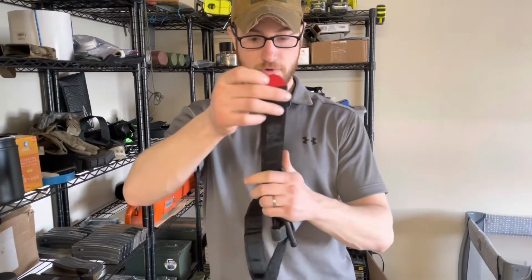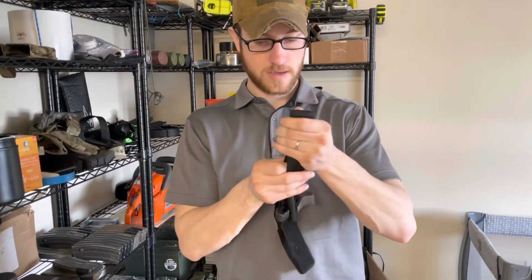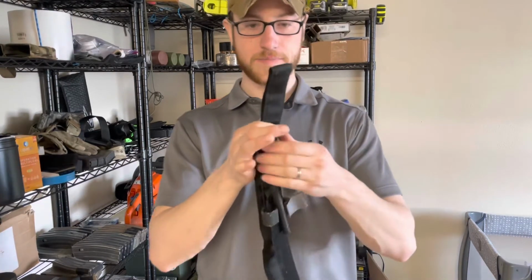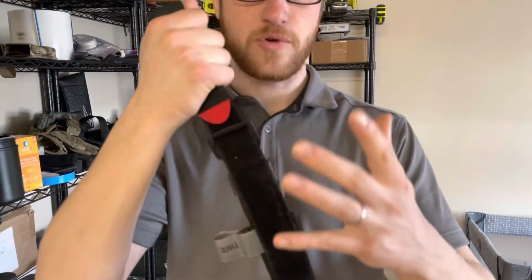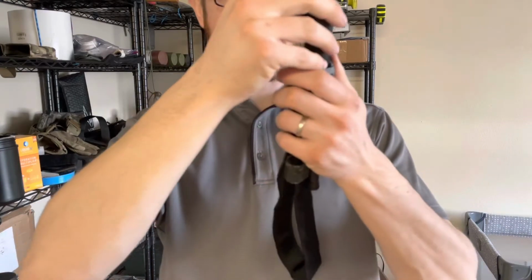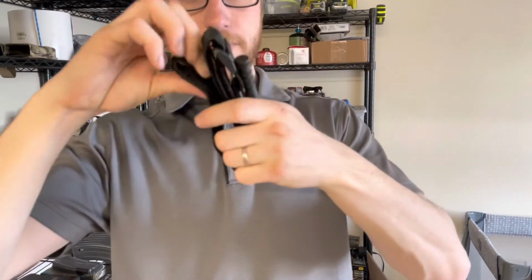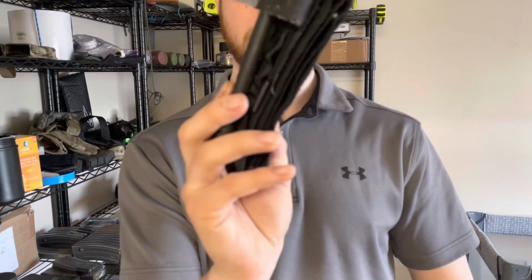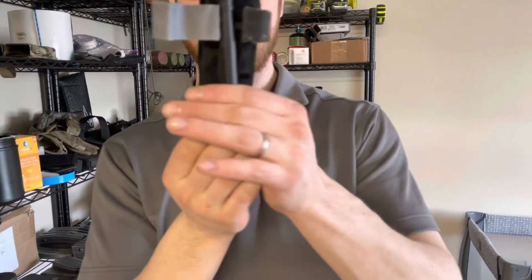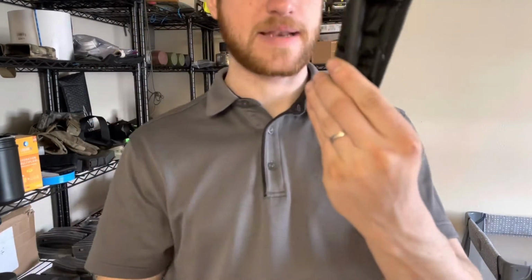I run my tab through, I make a little 4 or so inch bite of material. This allows me to have something a little meatier to grab onto with one hand if I'm doing a one-handed application. I then take this, run it out a little bit, fold it down, fold this up, and that gives me the package that I actually carry. I then slip this into a pocket that's inside of one of my pockets on my pants.